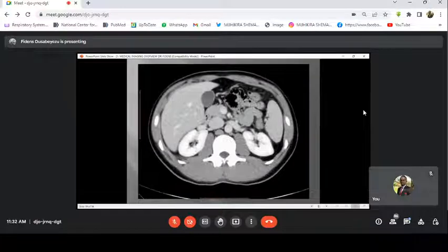These are the vessels: this is the abdominal aorta, this is the inferior vena cava here, and this is the left renal vein coming from the IVC. So this is the bone, the vertebral body, and the major psoas muscles. Those are soft tissue. This is the fat. This is air and intestines. From this, you can see everything in detail.